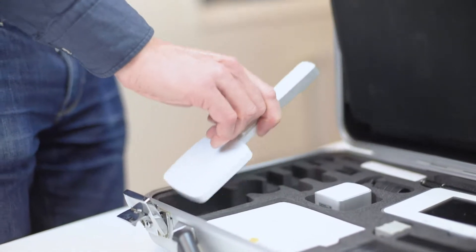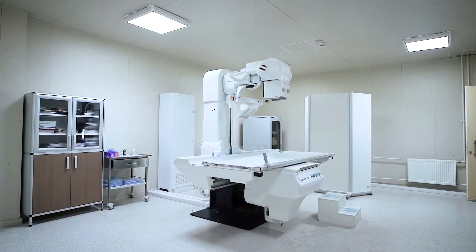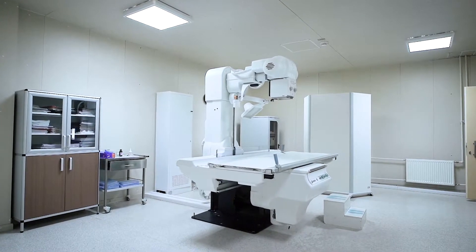Hello, today we will talk about the survey sensor of the Raysafe X2 meter for quality assurance and service of diagnostic X-ray. The X2 survey sensor covers X-ray survey measurement needs, such as leakage and scatter. It's primarily designed for X-ray but will handle also higher energies.